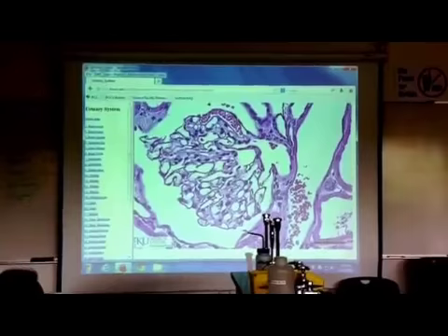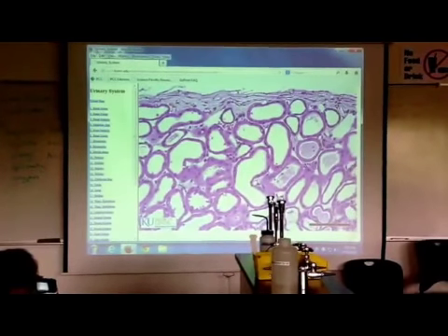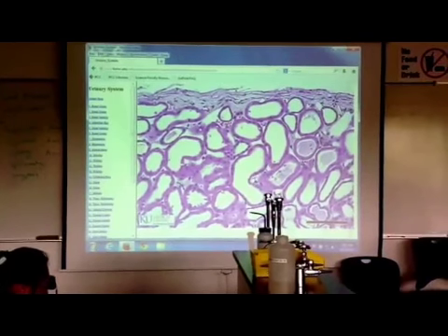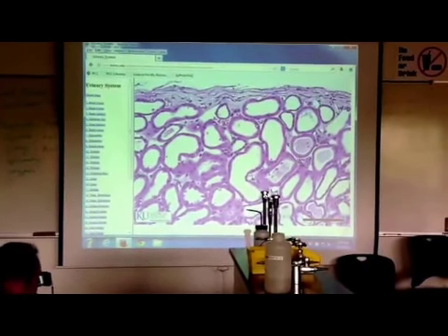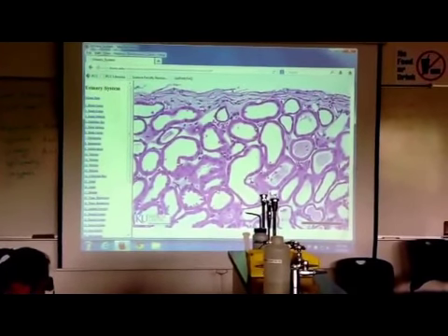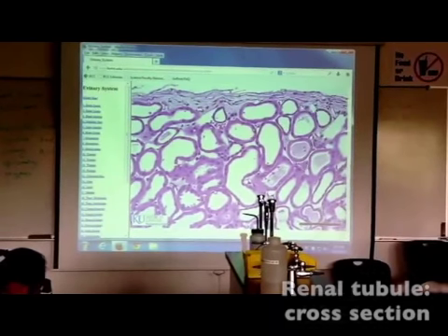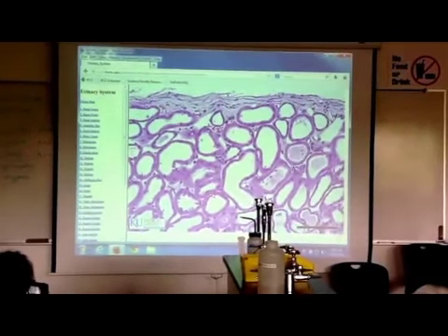The only other thing you can see easily on the slide, what do you think those things are? Fat? Nope, looks like fat. That's not. It's like some kind of mucus or watery kind of slimy stuff. Nope. Is it a cross-section of the tubule? It's a cross-section of tubules. Those are the tubes that are carrying the urine up and down. That's not the glomerulus, the corpuscle, that's the tubing.